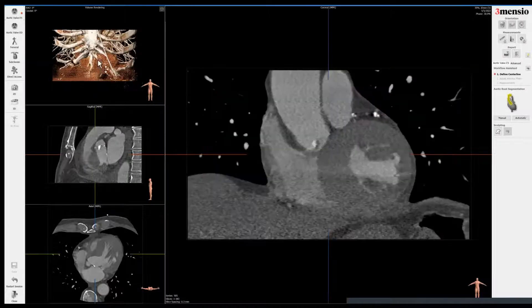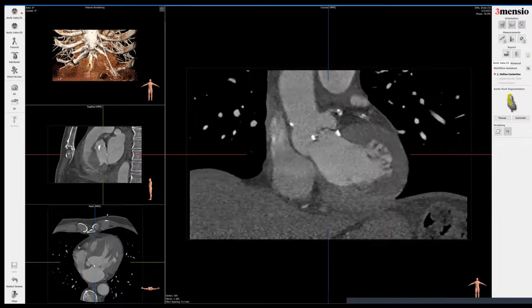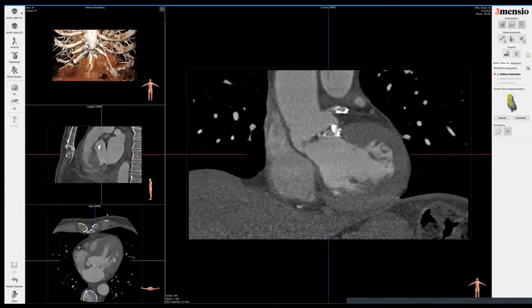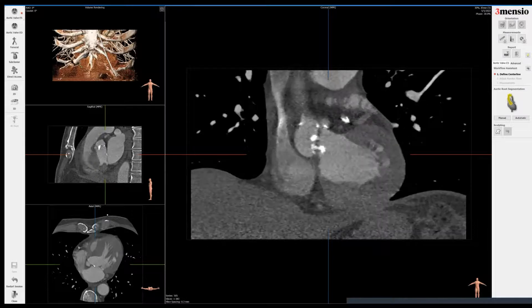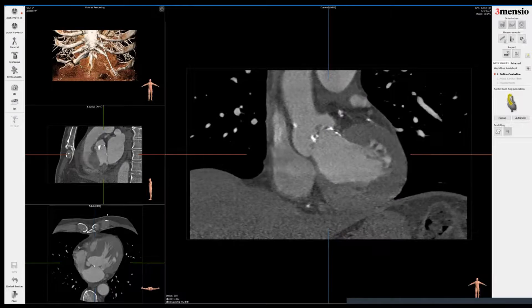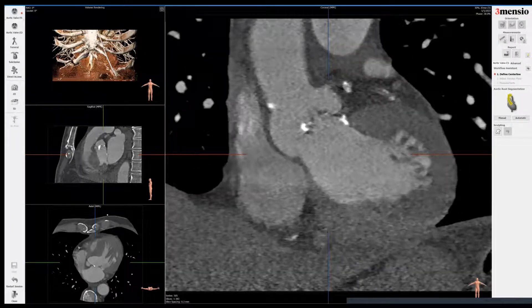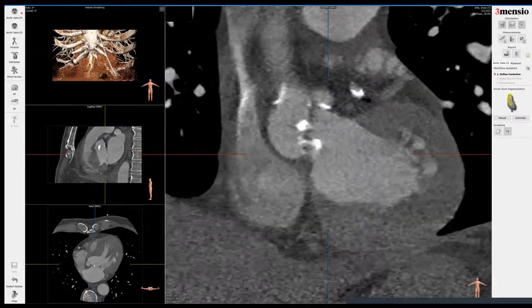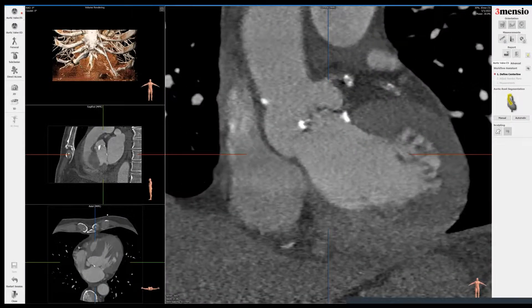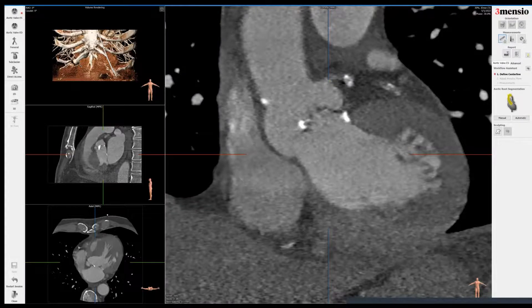Just like a prior presentation native workup, I'm going to look at the submembranous septal length. I look at the base. Now in bicuspid aortic valve, the septal length can be very short because that's just by the native anatomy — very close to the ventricular muscle. And that's also another reason why patients with bicuspid aortic valve undergoing TAVR can have a higher pacemaker risk.